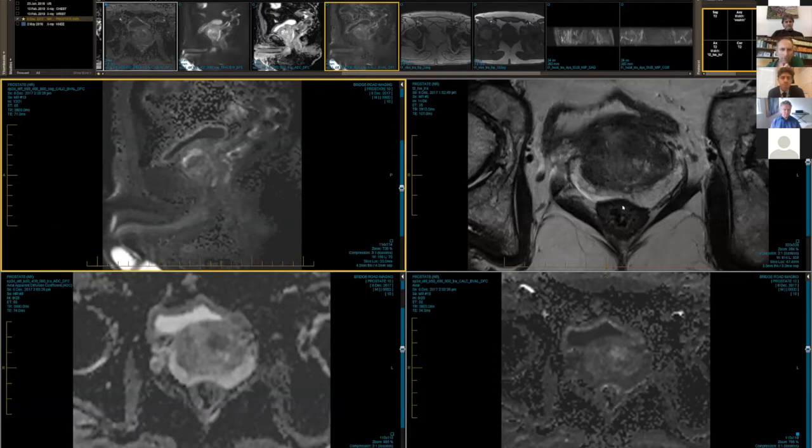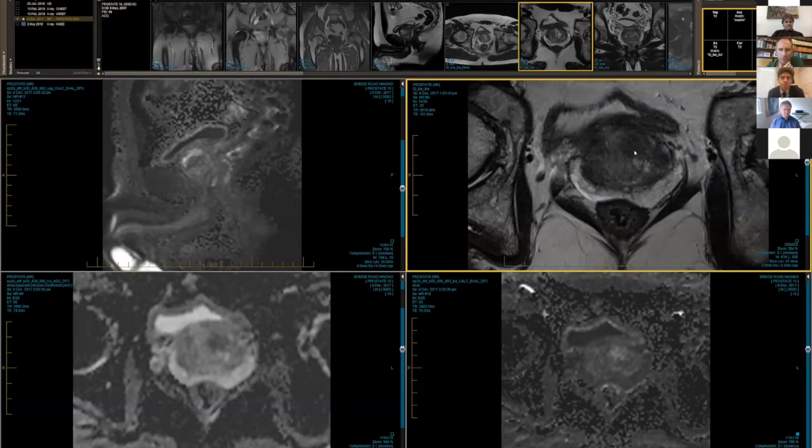I was just going to make that comment, Richard, that according to PIRADS, even though visually you could argue that you can see it more obviously on the diffusion weighted images, it's still the T2 which has to be the dominant series for transition zone, isn't it? That's definitely true in PIRADS. But what I would say is that if it's asymmetric and irregular, that's a very strong marker, even though we can see a well-defined margin at least on part of this lesion on two planes in T2. So it fits the PIRADS 2.1 description of an atypical BPH nodule, but it's got marked restricted diffusion.